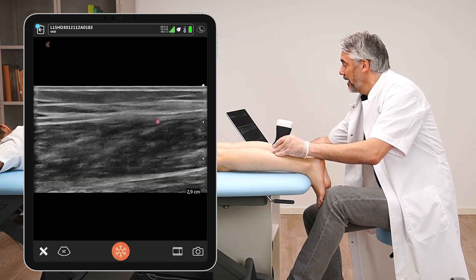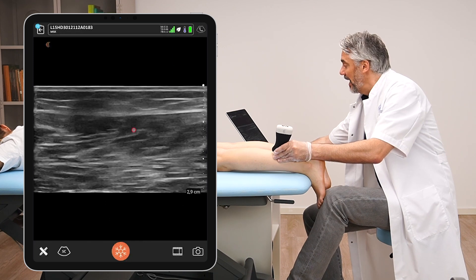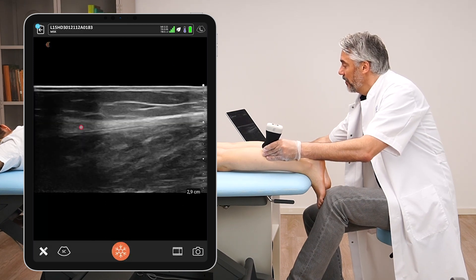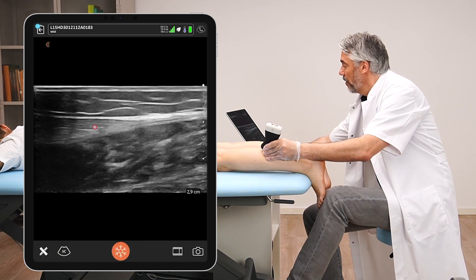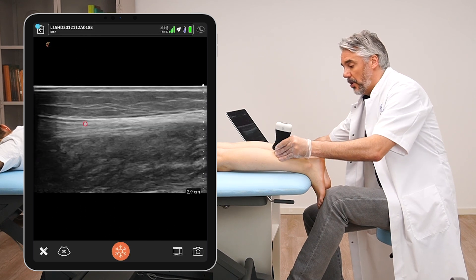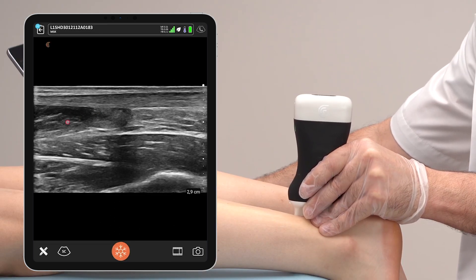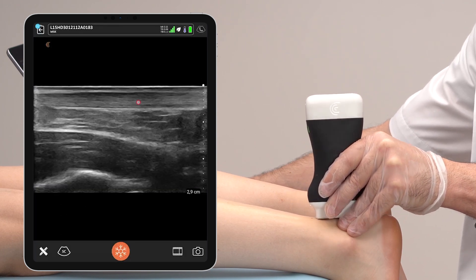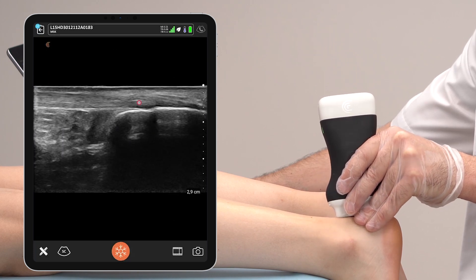The same examination can also be done for the lateral gastrocnemius. Moving to the lateral side, we will also see the lateral gastrocnemius muscle. Going back to the insertion of the Achilles tendon, we can see the soleus muscle inserting into the Achilles tendon and ultimately inserting into the calcaneal bone.